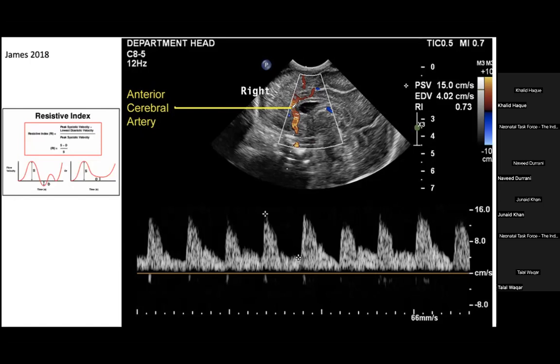And wherever you measure, you put the probe here, get the pulse wave Doppler here, and press the Doppler button, and you will find some shapes like this. Put your cursor here on the top, and the baseline here, this is the peak systolic velocity, and this is the diastolic velocity. This is just represented here to make it more clear. This is the top one, the systolic, and the down one is the diastolic velocity, or it will be like here.